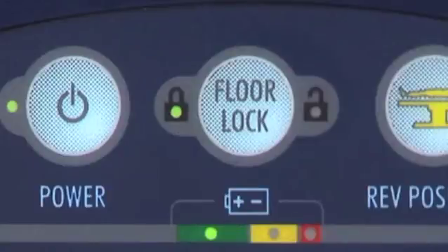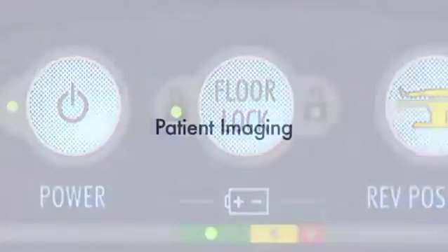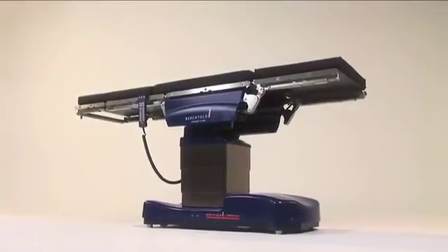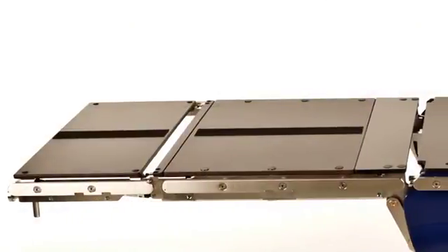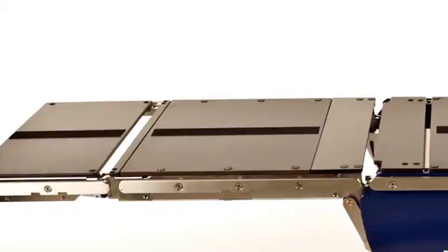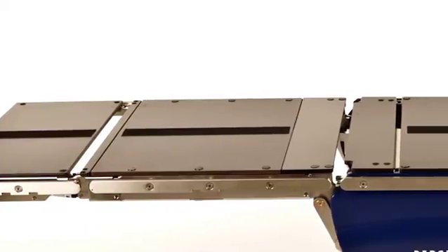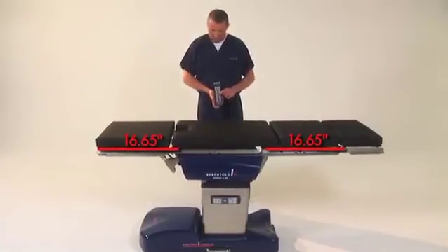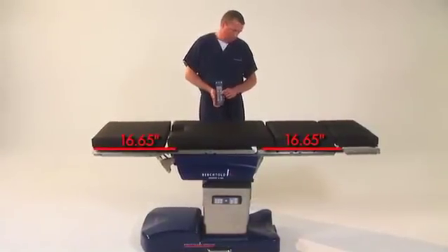A green light will appear when the table is in locked mode, indicating it is safe to articulate the table. The D820 is designed for superior imaging access. The radiolucent phenolic tabletop construction improves image clarity while minimizing risk of exposure to patients and OR staff. 16.65 inches of longitudinal slide provides superior C-arm coverage without the need to reposition or reverse the patient. The space between the side panels is open, allowing the C-arm to slide all the way to the column.